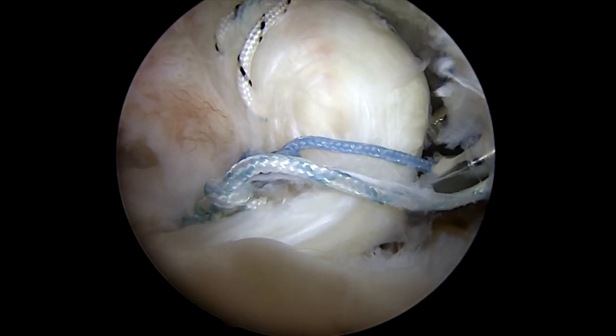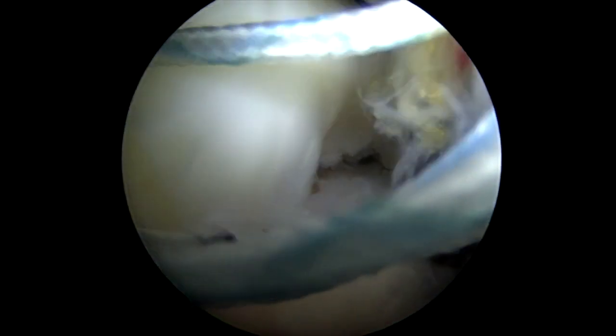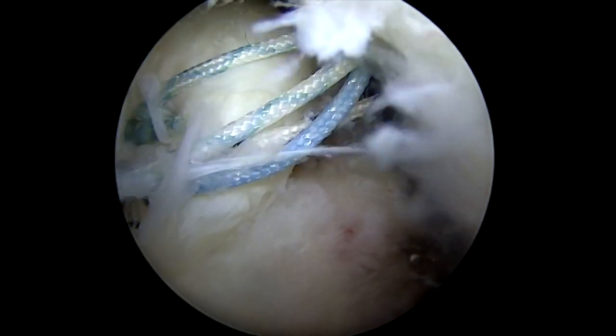Once all of the knots are tied — which is what I'm going to show you here in a second — you can see how the inside of the tendon is down but the outside of the tendon is still flipped a little bit up. It almost looks like there's a little valley there, so we're going to place a second row of anchors on the outside.